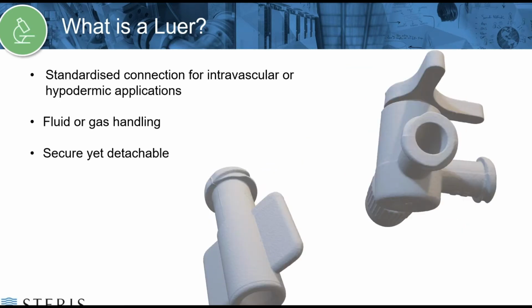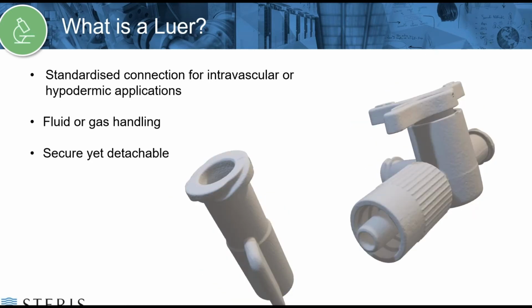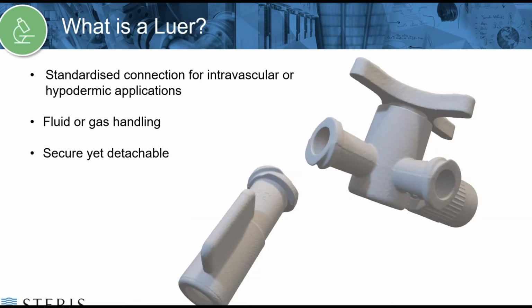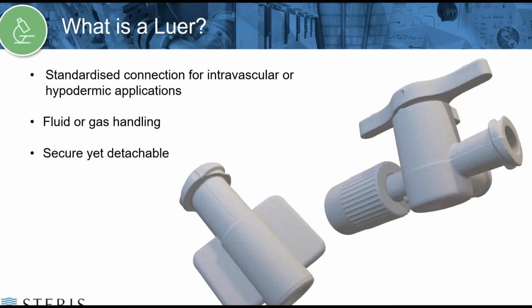The design dates back to the 1800s, and the overall concept of design has remained relatively unchanged. The purpose of these connectors is to provide a leak-proof, in-line connection for fluids or gases in a healthcare setting. The connectors are designed to maintain a secure yet detachable connection that cannot be misconnected with other connectors.